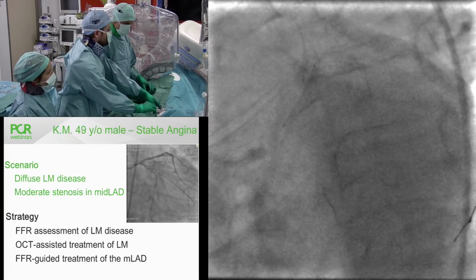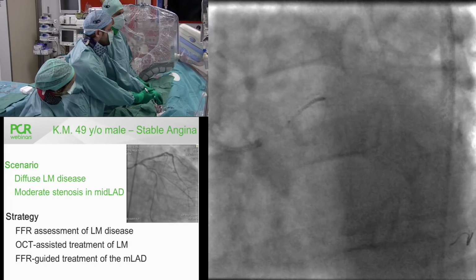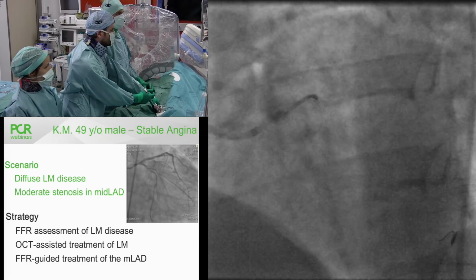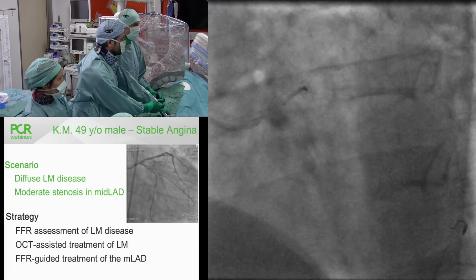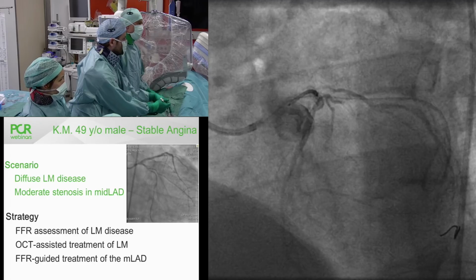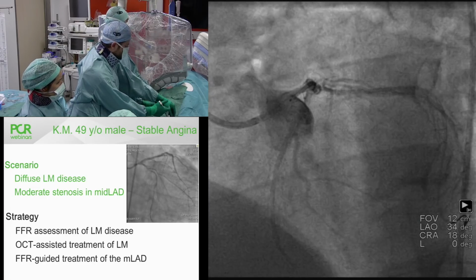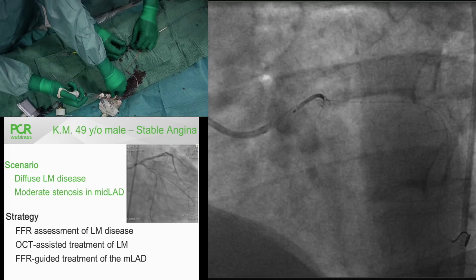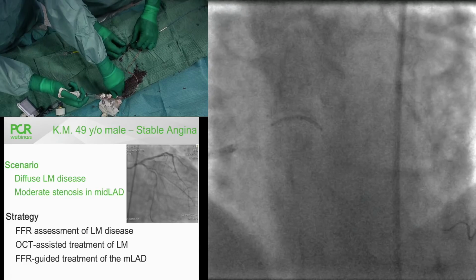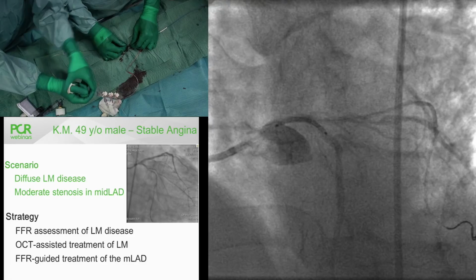Let's reason theoretically. What is the best projection for this kind of position? It means the left main proximal LAD. You can also go LAO cranial. I think we are almost there, but this was also the proposal of a couple of colleagues, to take an LAO cranial. Yeah. Yeah, but I think the proximal part is okay, but more cranial and more fast.